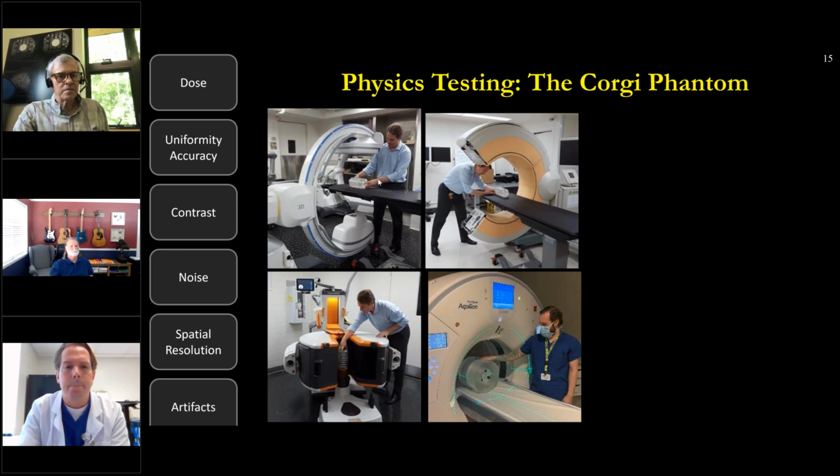Jeff, when you talk about generalizability, if I did a sinus CT scan with a whole body CT scanner and it told me that I was delivering, say, 6 millisieverts, for example.